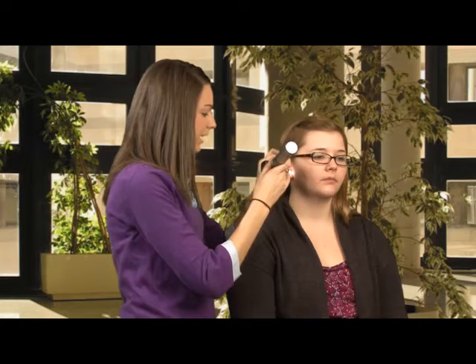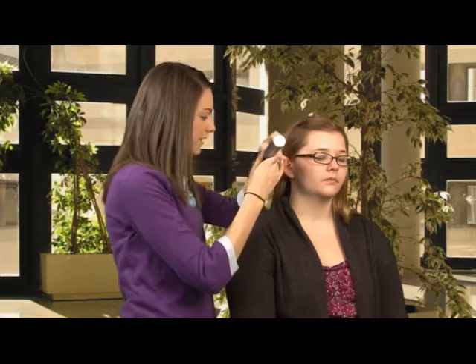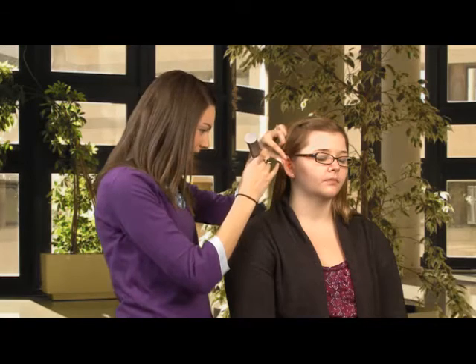I'm looking on the front side and also looking behind her ear. I'm looking for any abnormalities in her skin color, the shape of her pinna, and also if there's any swelling, growths, or anything like that.